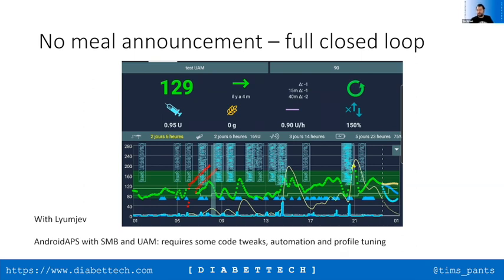This is where it becomes a person by person kind of scenario. What we have noticed about the faster insulins is that individually people seem to react very differently, and as a result, what you need to do to make things work for you is potentially more complex, and there's not necessarily a pattern across users that is immediately obvious.